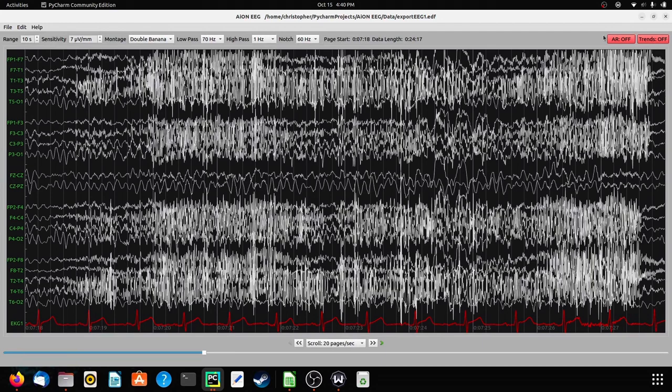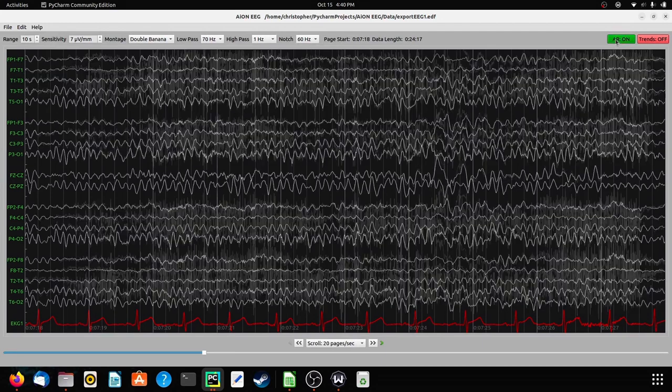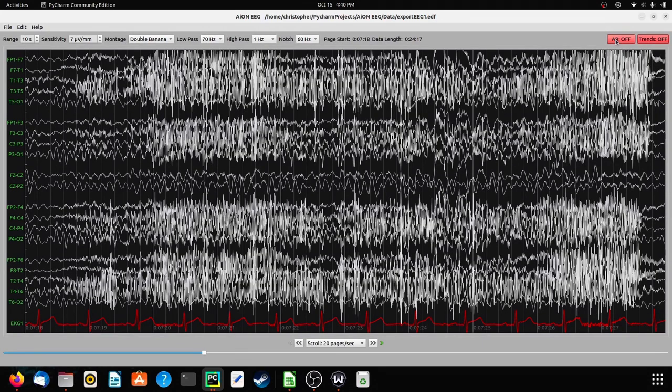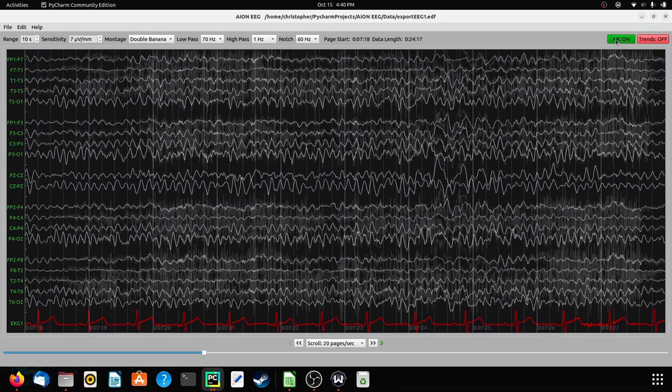Hey everyone, Jared Beckwith here. In today's video, I wanted to talk about how our EEG software feature of artifact reduction reduces things on EEG brain recordings that aren't coming from the brain. You don't want any noise on the recording — you want it to be nice and clean for the doctor to read. Our feature, artifact reduction, does just that.